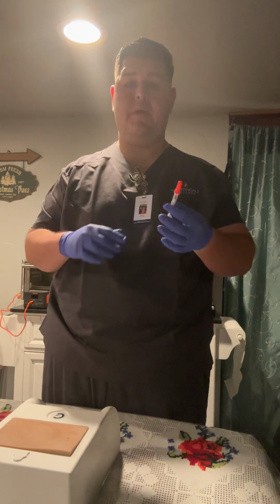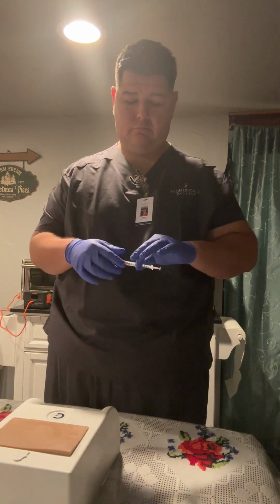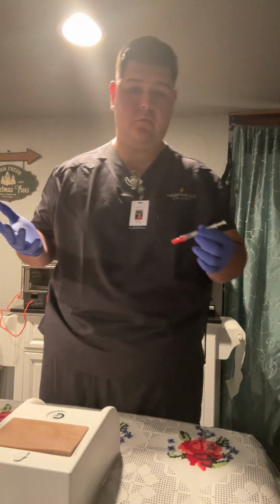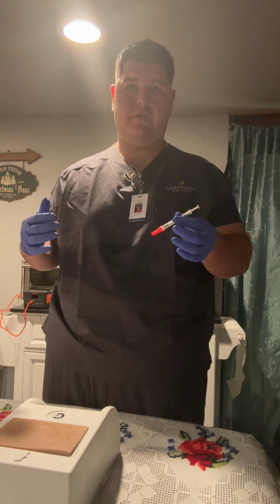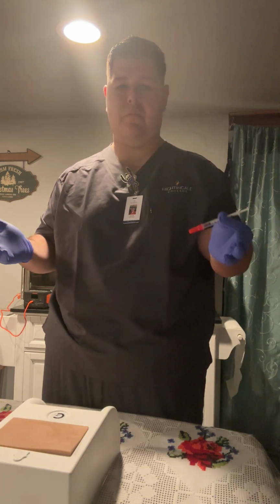And like I said, I want to ensure that the bubble portion of the syringe is essentially moving upward upon injection. So this portion upward while I'm injecting. And I will inject the needle with the bevel up at a 5 to 15 degree angle. I need to ensure that I feel the resistance. Once I feel the resistance, I can keep, or not essentially keep moving, but that's how I know I'm at the spot I need to be.